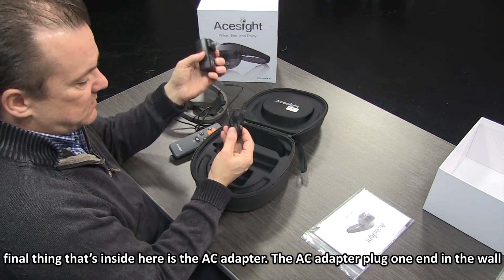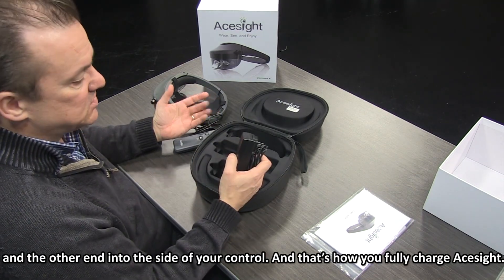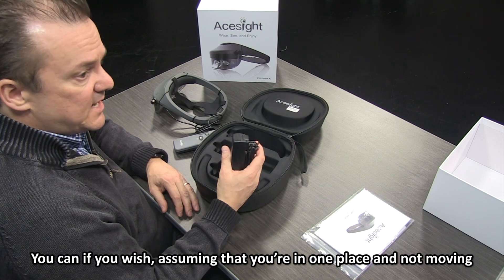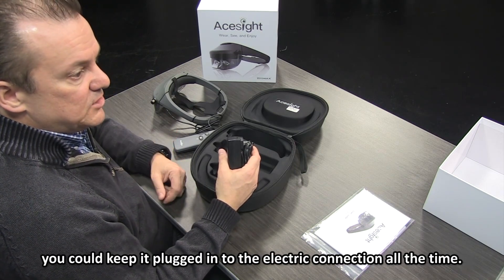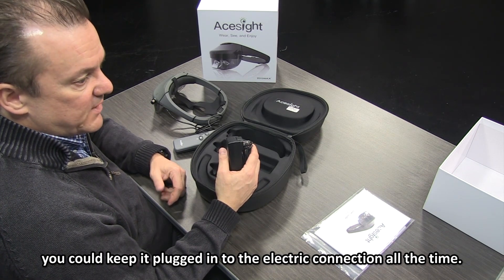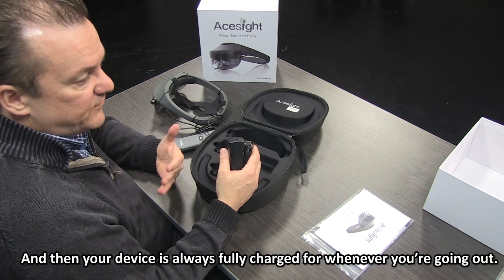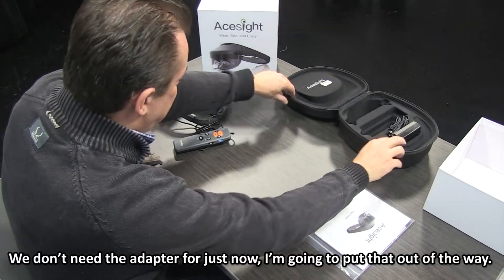The third and final thing inside is the AC adapter. Plug one end into the wall, the other end into the side of your controller, and that's how you would fully charge ACE Sight. You can, if you wish, assuming you're in one place and not moving, keep it plugged into the electric connection all the time — your device is always fully charged for whenever you're going out.